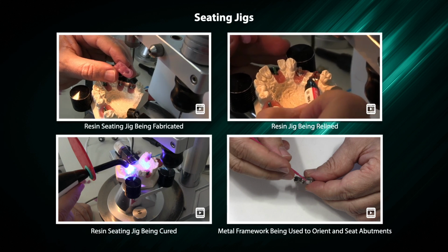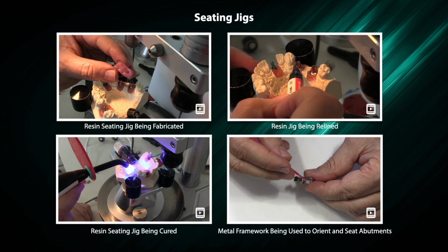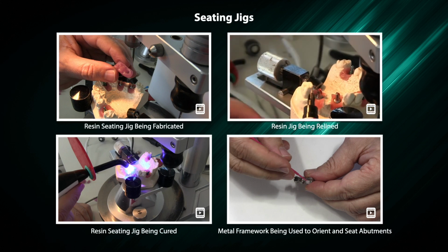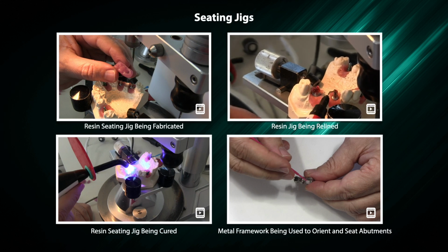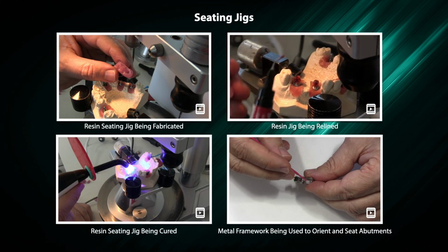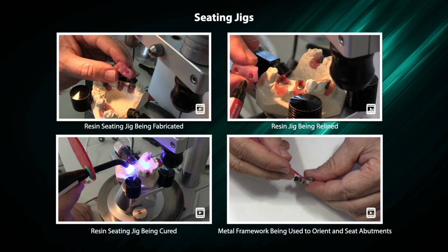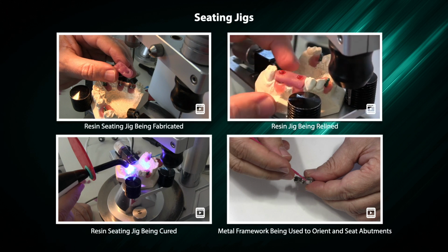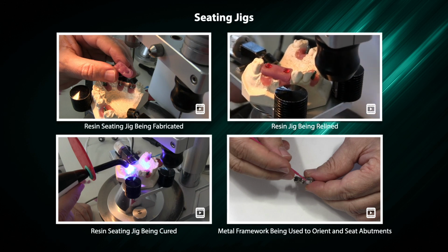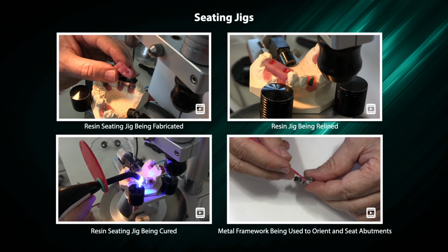Resin jig being relined. Resin seating jig being cured.